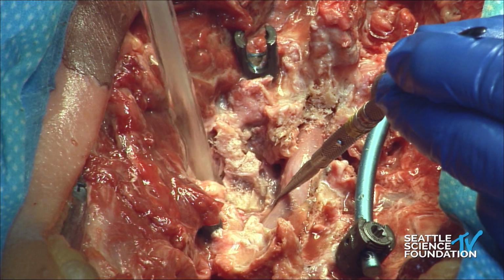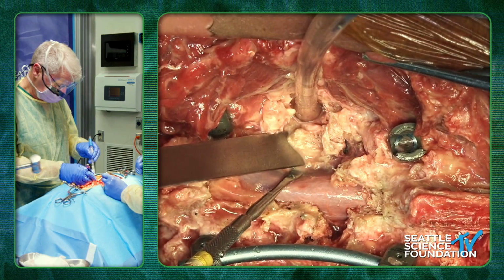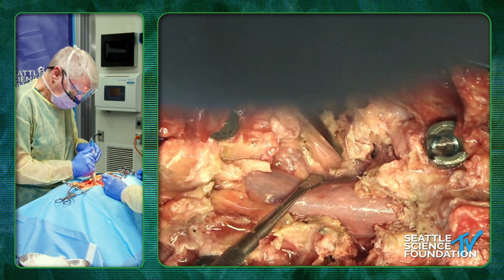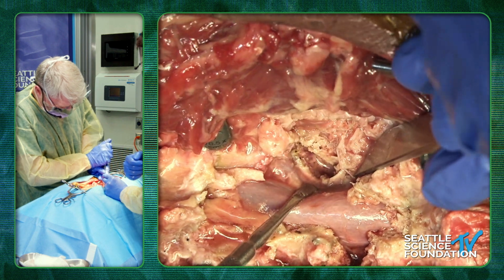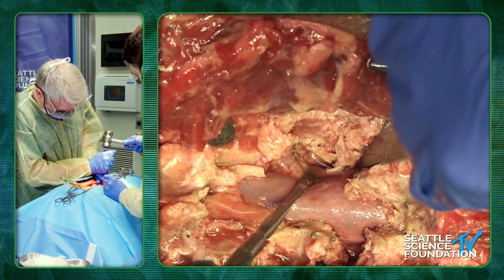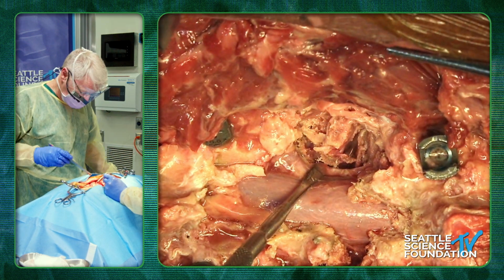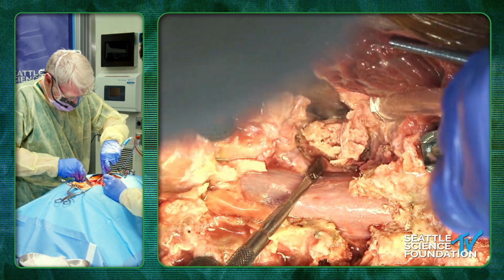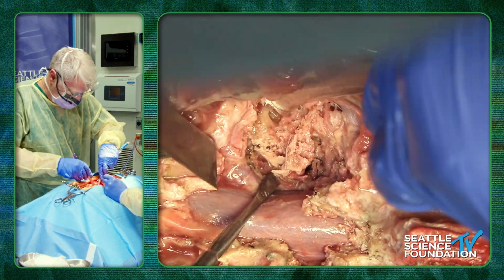Okay, so now we have basically a release here on an angle. And give it a little tap. And we're going to take out this part here with the pedicle. Okay, so now this whole thing is loose here. So I've taken out the pedicle and the lateral body here in a triangular fashion. So you can see it's angled as a triangle. I want to take that out, Colin?